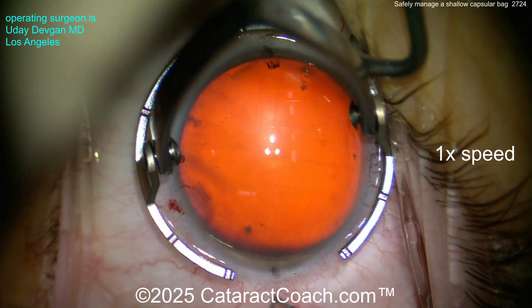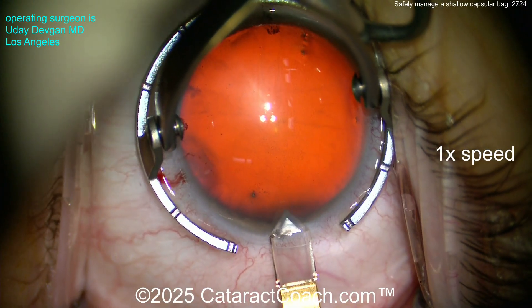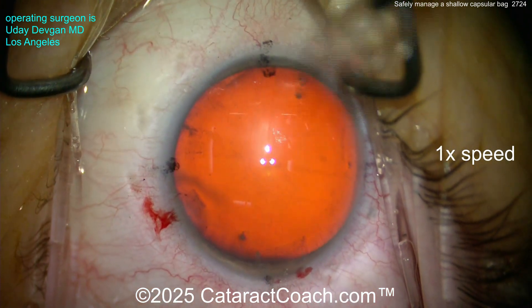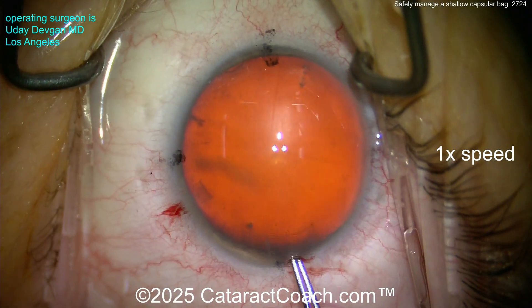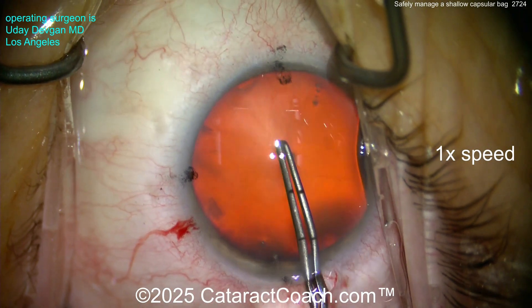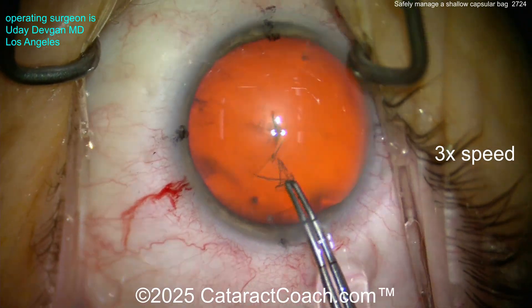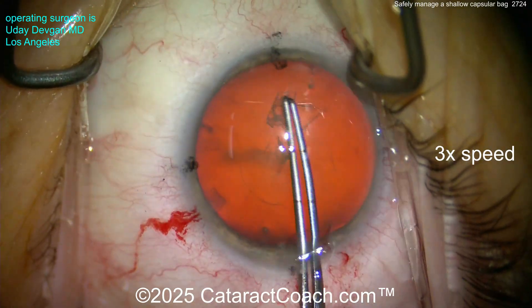We'll start with the main incision, but I knew we were going to have some challenges. When I do the rhexis, there's some wrinkling or laxity of zonular support. As I poke into the lens capsule with these forceps, normally if the lens capsule is nice and taut — well supported — it should be easy. But look at those radial wrinkles. That sign right there tells me there's overall zonular laxity.